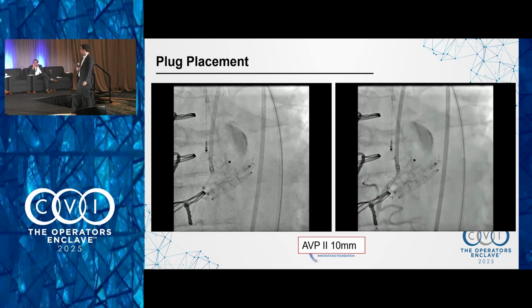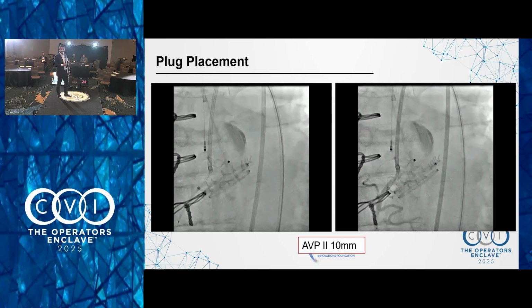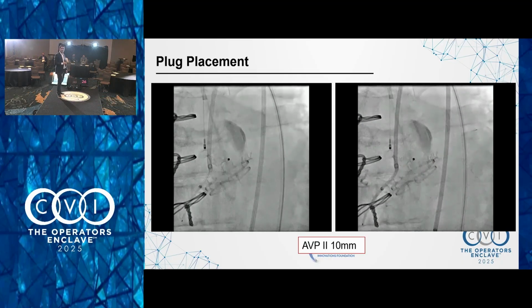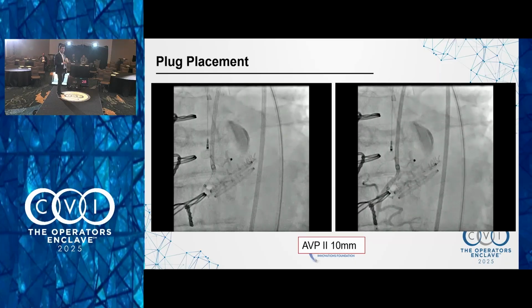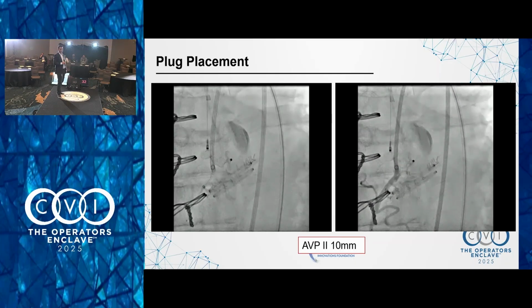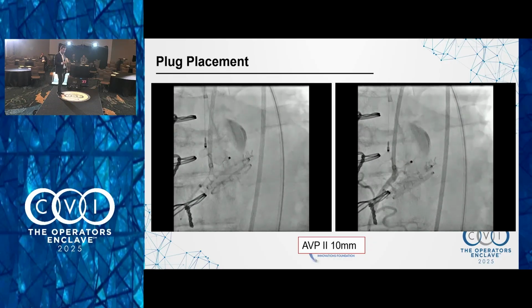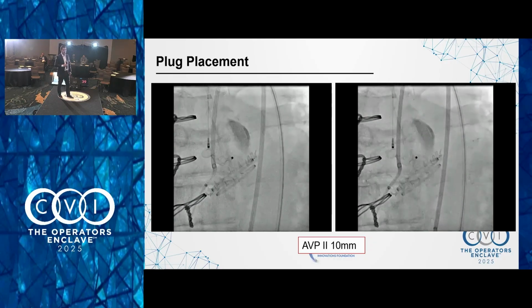I would actually release the tension on the cable and try to get a sense as to where the plug is going to be, then deploy the stent, but still leave the cable attached in case I didn't like it. That would be your last move. Right now you're pulling on the plug, but I would give that tension back. Yes, which is exactly what I did.